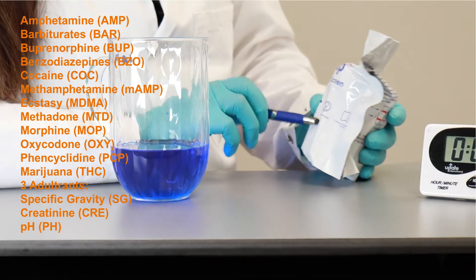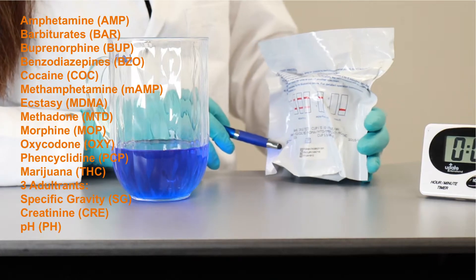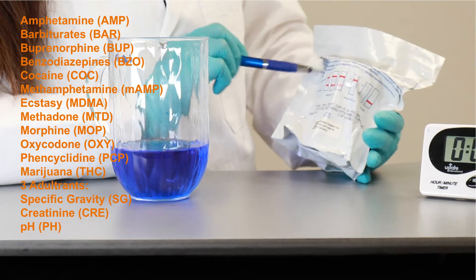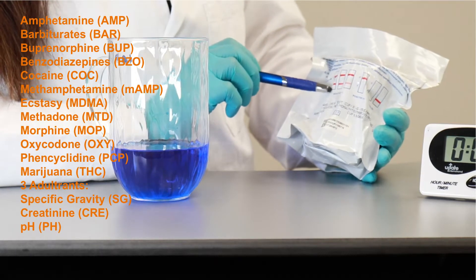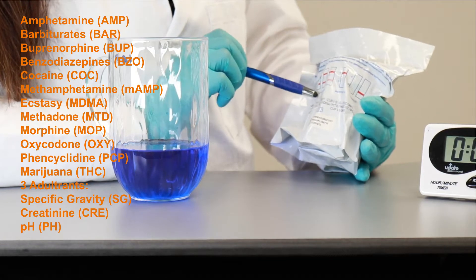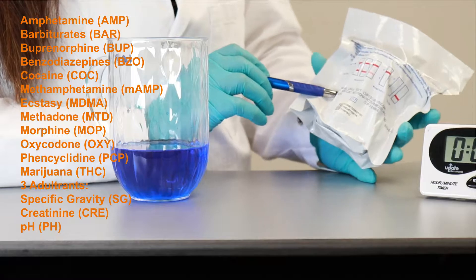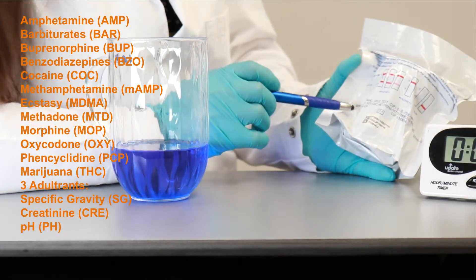They are not supposed to be reused. There are instructions in the back of the cup that I'm going to show you stepwise. These are really easy to follow. And after the test is done, these are the result indications that you can read: negative, positive, and invalid. So this particular drug test is a 12-panel cup. The 12 panels include all CLIA-waived drugs.